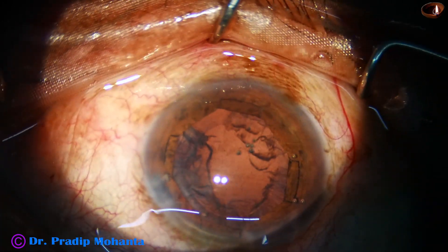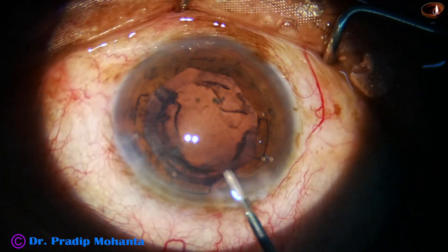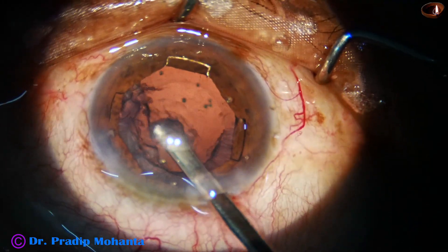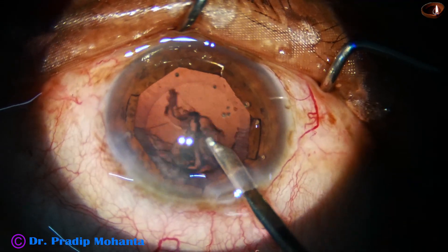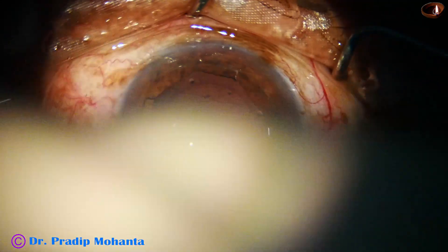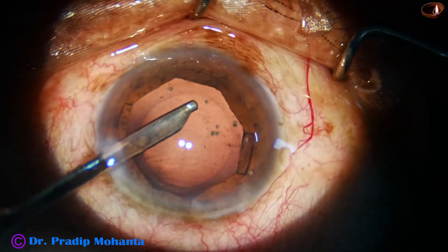Now the cortex is remaining. There is no problem in using coaxial IA. There is only one side port. I am using a 23G Simcoe. Since you have only one side port, either you use a coaxial IA or a 23G Simcoe cannula. Cortex is removed.